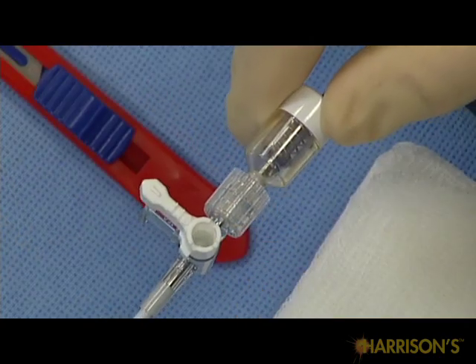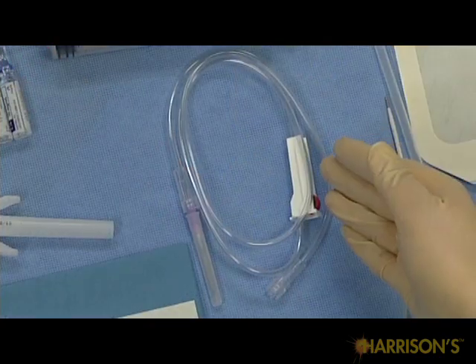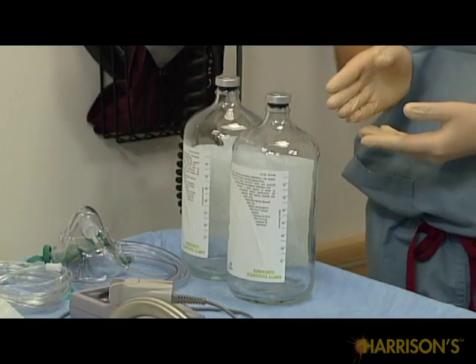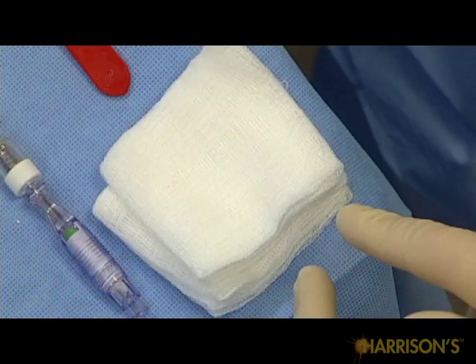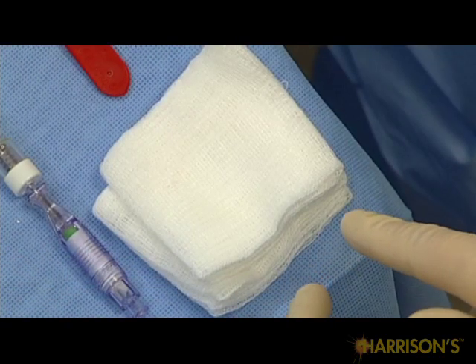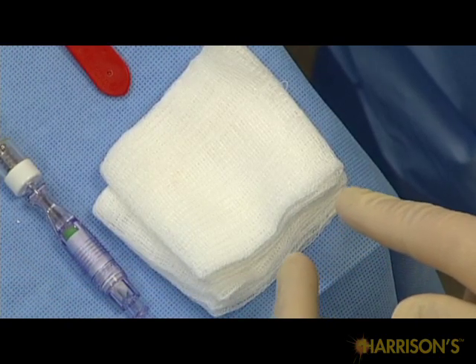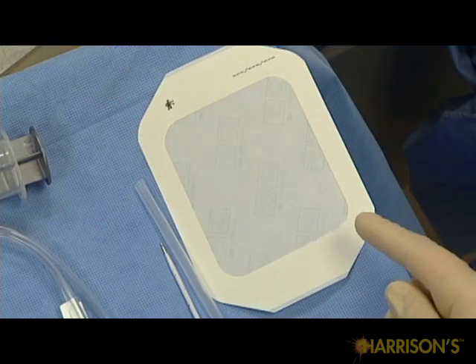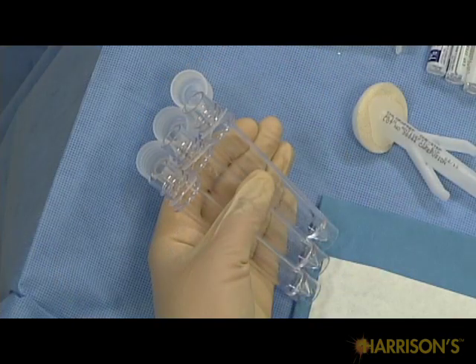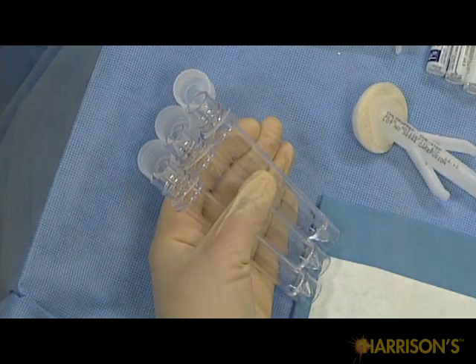3-way stopcock. High pressure tubing. 2 vacuum sealed 1-liter bottles. Several pieces of small sterile gauze, 2 by 2 inches squared. Occlusive dressing, for example, Tegaderm. Tubes for lab analysis, gram stain and culture, cytology, chemistries, cell counts.